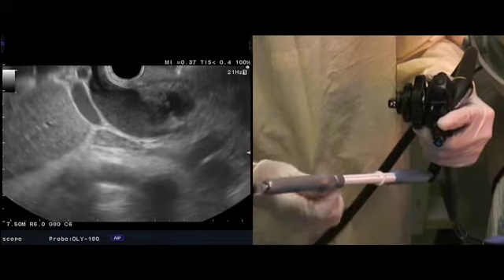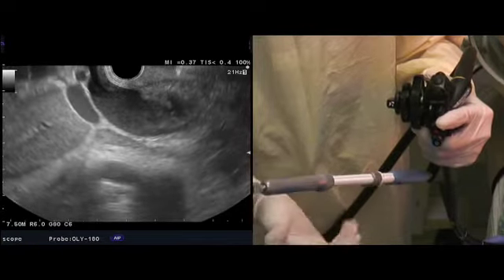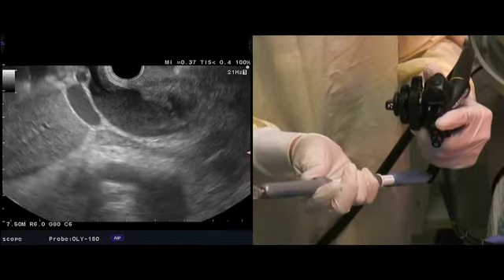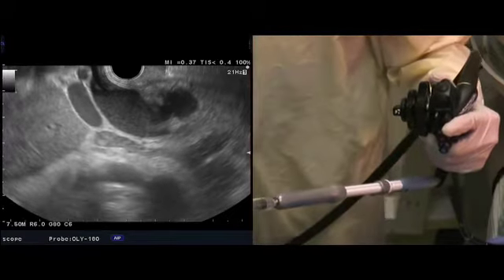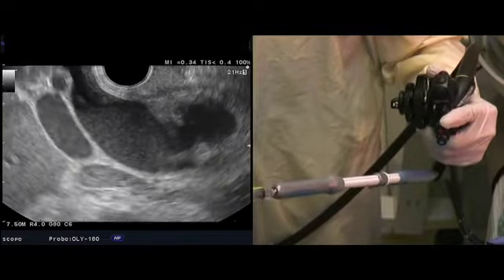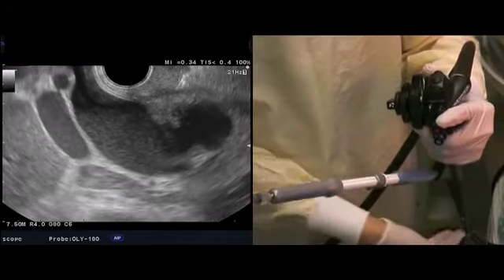Now we're going to unlock the second thumb screw to allow us to advance the needle forward. I'll push the needle forward — you can see the needle, it's very echogenic. We'll magnify a couple of times here, and the next step is going to be to puncture the duct.